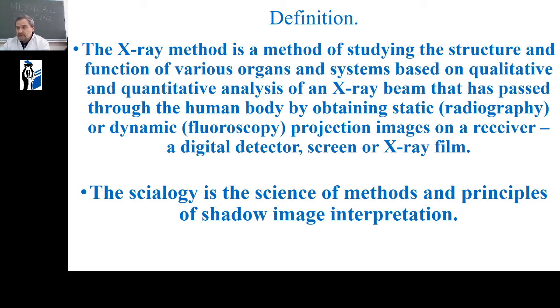Another definition that has Greek roots is skiology, because radiographs are a shadow image. Then skiology is the science of methods and principles of shadow image interpretation.